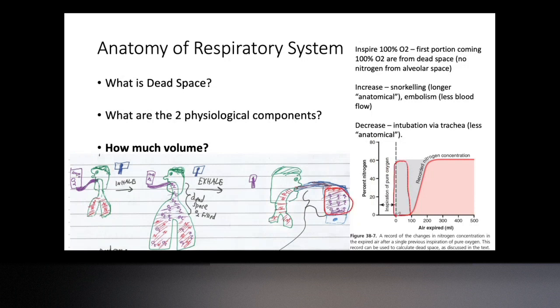So this portion over here is basically the O2 which was his dead space. So this gray area is his dead space, all this gray area. So that's how you measure the dead space. Okay? Everyone's okay with this? How you measure the dead space?